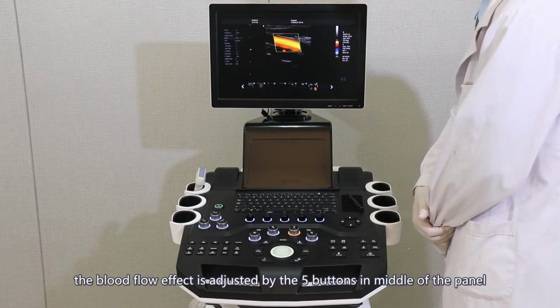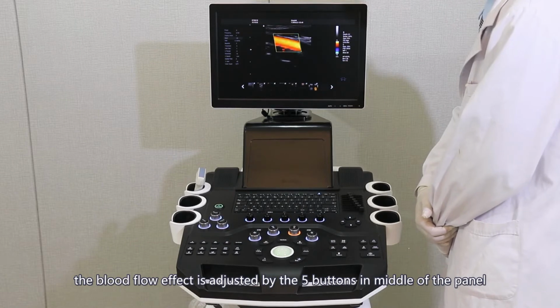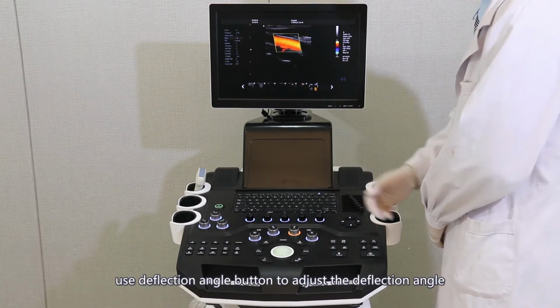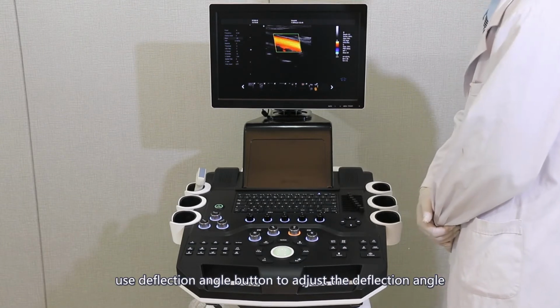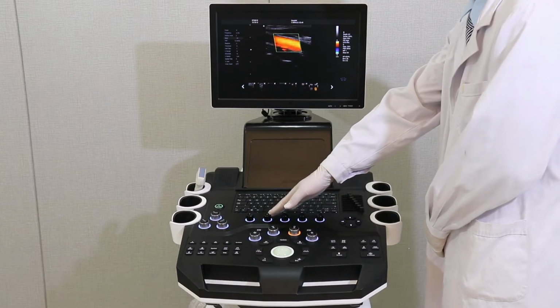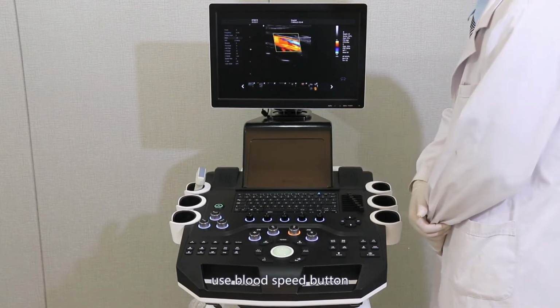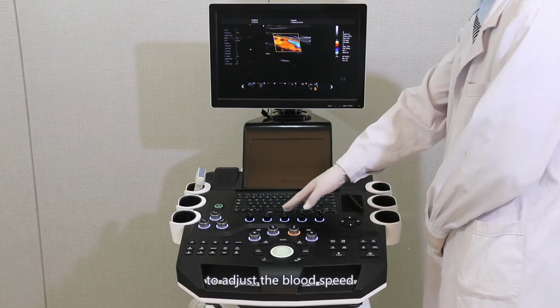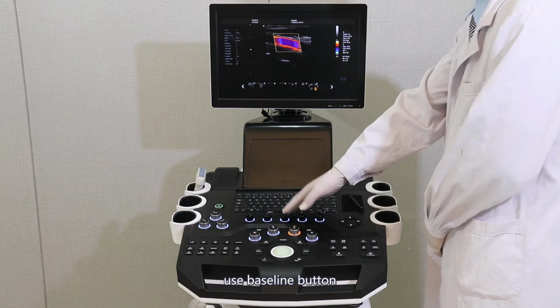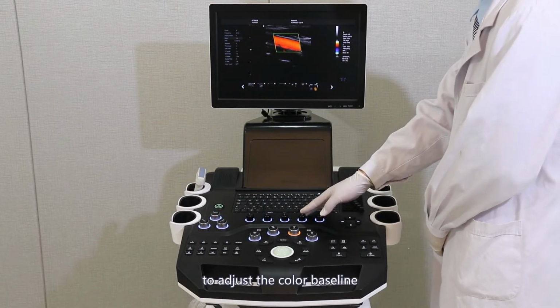The blood flow effect is adjusted by the 5 buttons in the middle of the panel. Use the deflection angle button to adjust the deflection angle. Use the blood speed button to adjust the blood speed. Use the baseline button to adjust the color baseline.